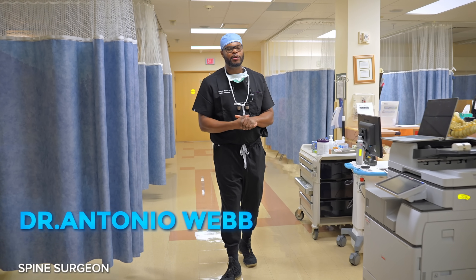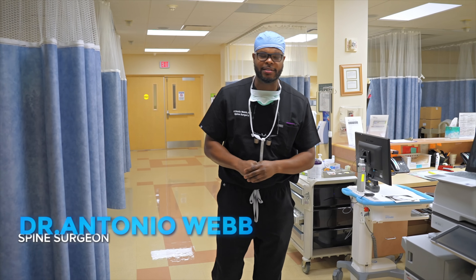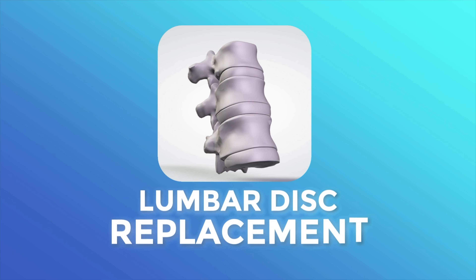All right guys, Dr. Antonio Webb here, orthopedic spine surgeon here in San Antonio, Texas. Today we're doing a lumbar disc replacement.